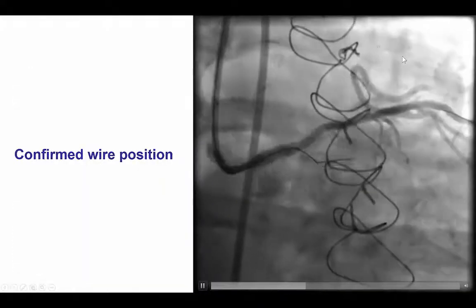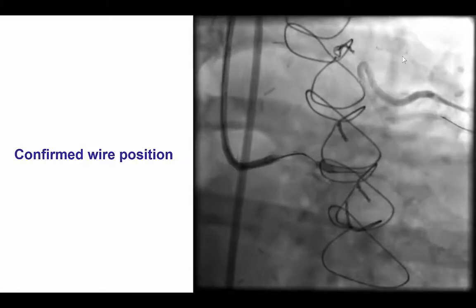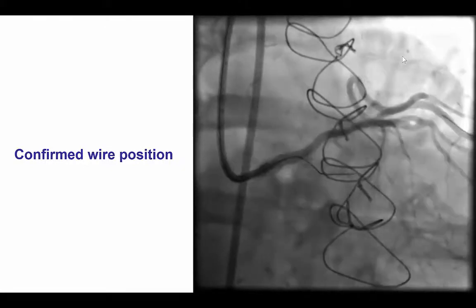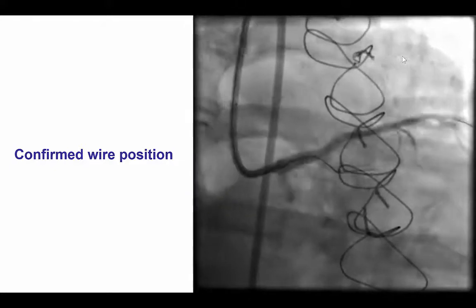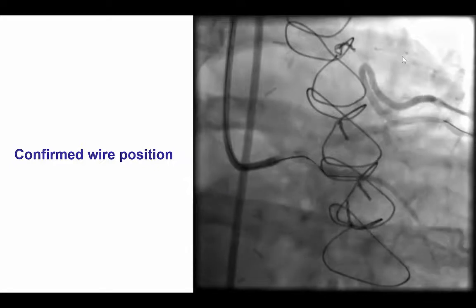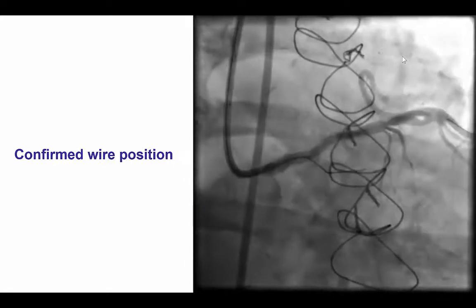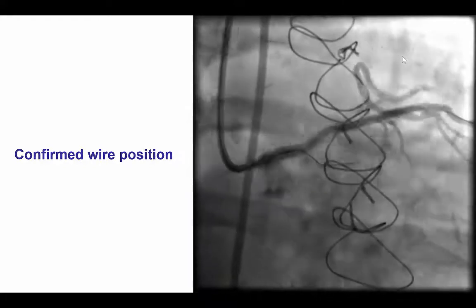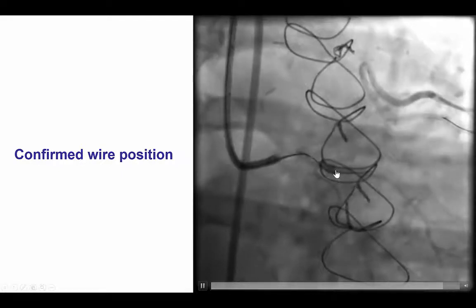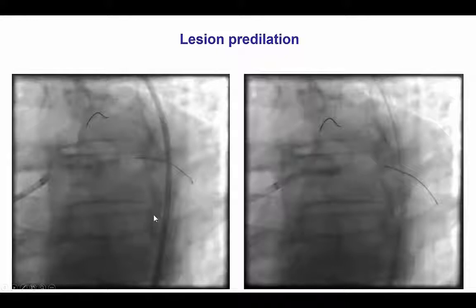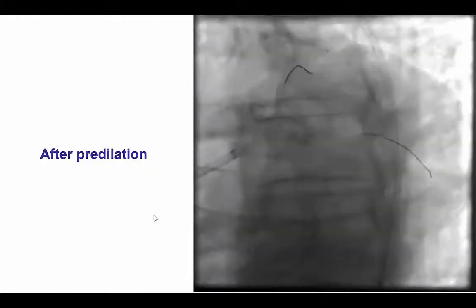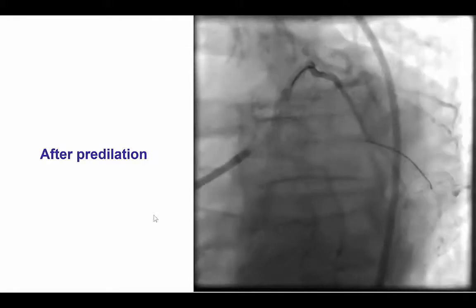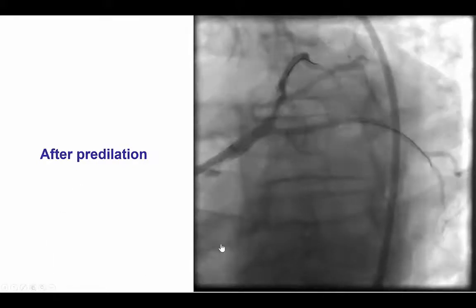Before we do anything, the first step is to confirm that the wire is where we think it is — either in the distal true lumen or within the vessel architecture. We do an injection, and in this particular case there were no contralateral collaterals, so the whole case was done through a single 8-French 3.75 EBU guide catheter. The wire does seem to be within the true lumen, confirmed on contralateral view. The wire was changed for a soft workhorse guide wire, followed by predilatation of the lesion, which restored TIMI flow into the obtuse marginal as well as the distal circumflex.